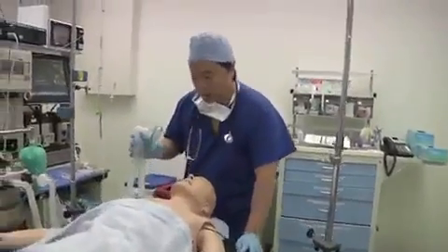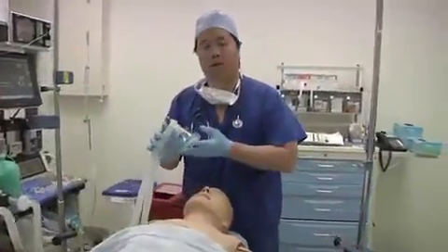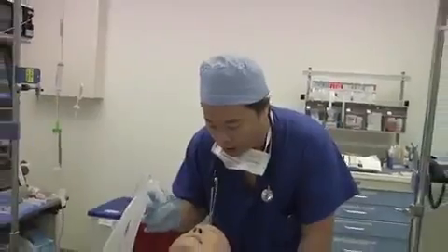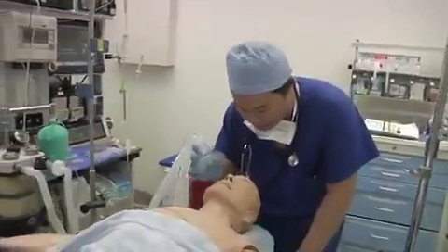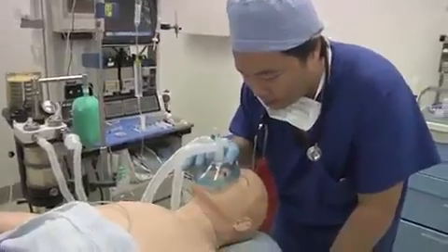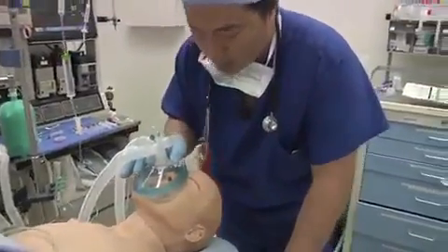Okay, it's squeezing now. The other thing I want to mention is placement of the oxygen mask on the patient. Some patients are claustrophobic, and you might not know in advance, so I always like to warn the patient. So, Mr. Johnson, I'm going to put a little oxygen mask on your face. Is that okay? Okay. All right. It's going to smell a little bit like plastic, but that's normal. Yeah, it sounds a little funny.